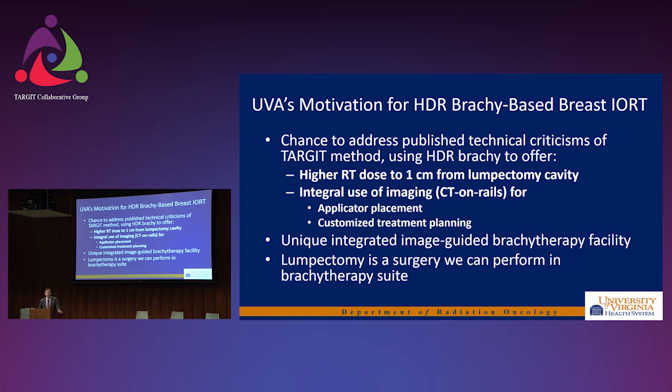So we also viewed HDR brachytherapy as a chance to address some of the technical criticisms of the TARGIT method, which we had read about. None of us had any experience using that, but it's something we had read with interest. We hadn't yet shown it at this point, but if you use HDR brachytherapy, you know that you're going to get more coverage of what's deep to the applicator, so we get more depth dose. So we felt that maintaining the same applicator surface dose, our dose at 1 centimeter beyond the lumpectomy cavity, for example, would be higher. So we could address criticisms about the low dose to 1 centimeter beyond the lumpectomy cavity.